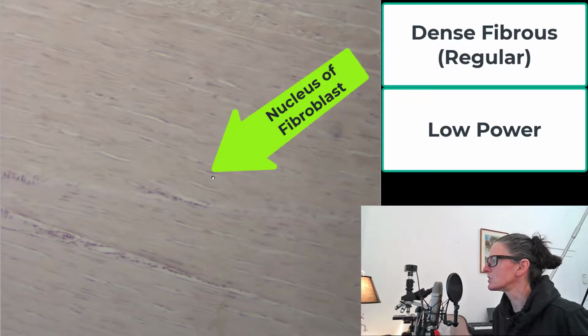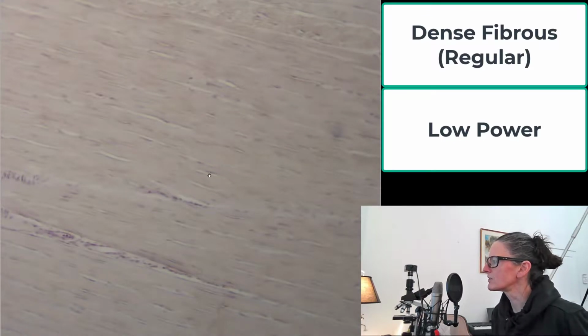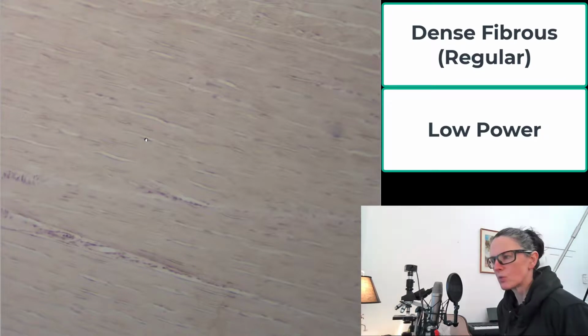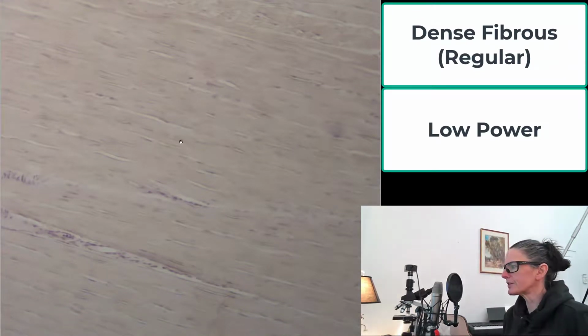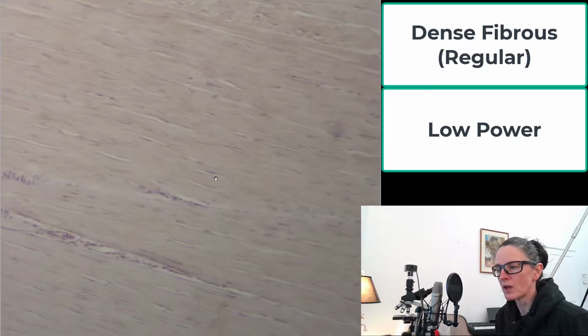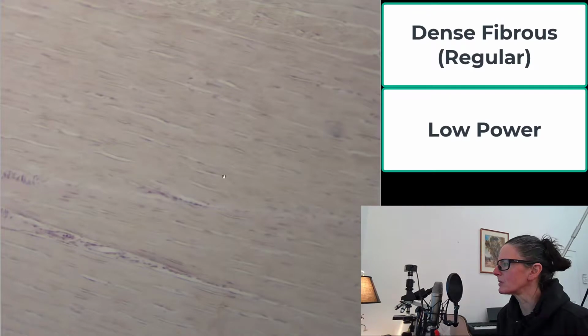And then we have the nuclei of the fibroblasts that make the stuff, and they're usually kind of elongated. And sometimes they can be wavy and almost angular. One of the things to be very aware of, as I mentioned in one of the previous videos, is these nuclei can stain anywhere from pink to dark purple. And oftentimes on first blush, it looks a lot like smooth muscle because of the coloration and the fact that you have this background of pink with these nuclei interspersed between them.